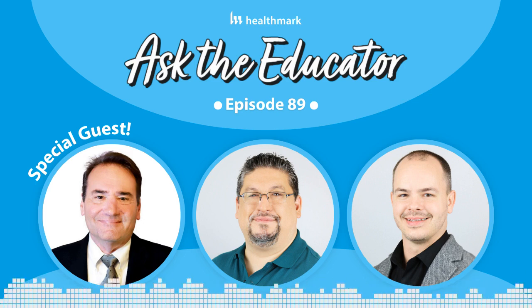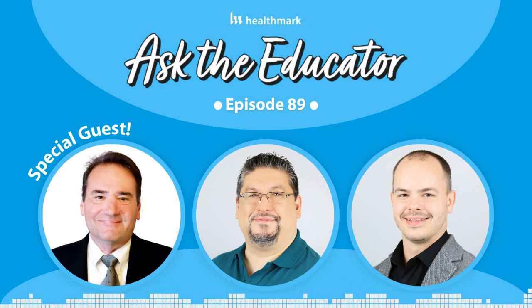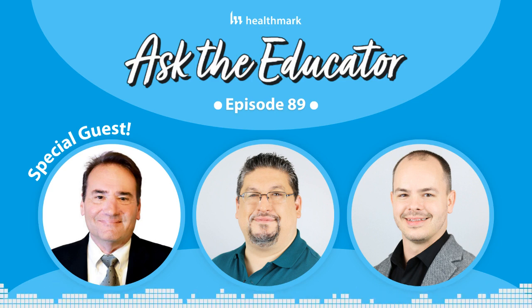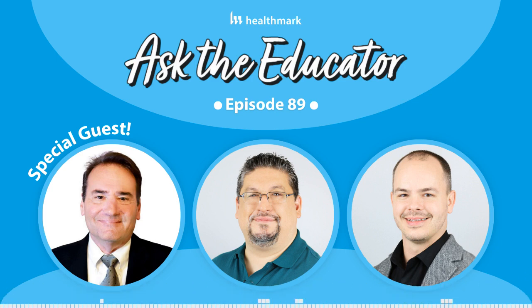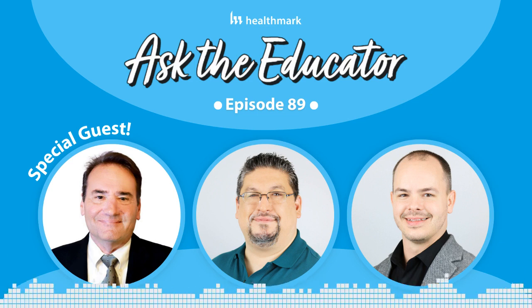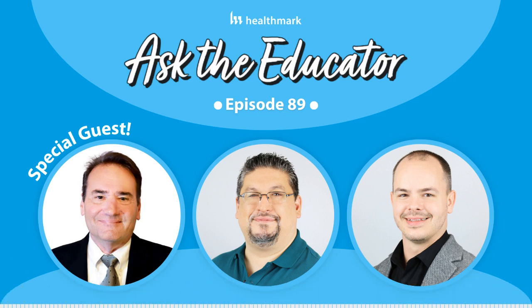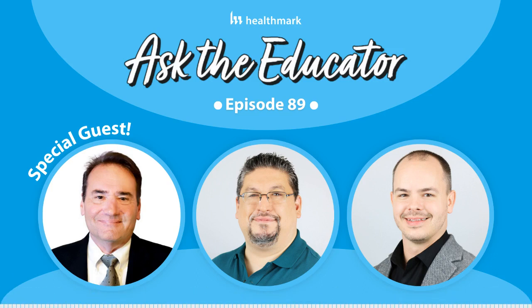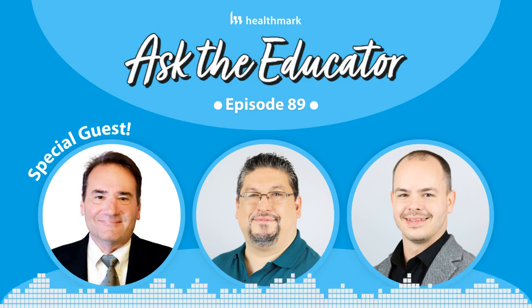And the fact that you need to test for two analytes, that's a big deal. For a long time, and again, that's for critical and semi-critical devices, it was just one marker. The other thing that's really important, and in a way I wish I'd stressed a little bit more during our talk, is that it's got to be visibly clean. That's really stressed in ST98. So it's not just, we passed this chemical test. No, if I look at it, is it clean? And that's the same thing in the healthcare facility. So those are some key changes.